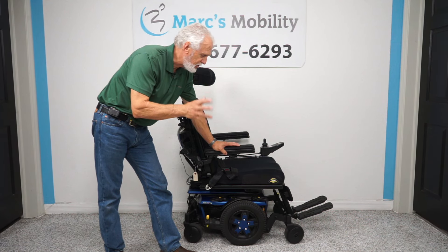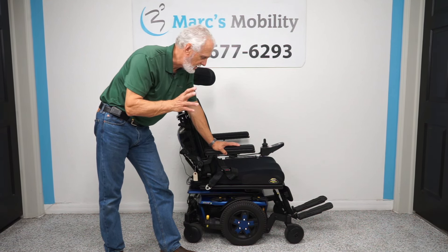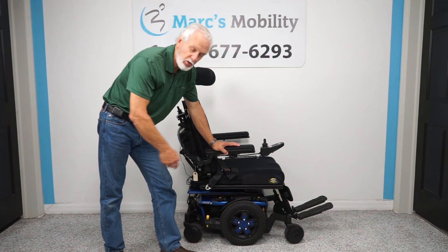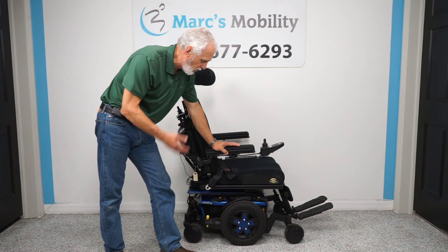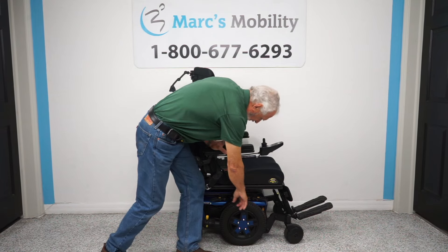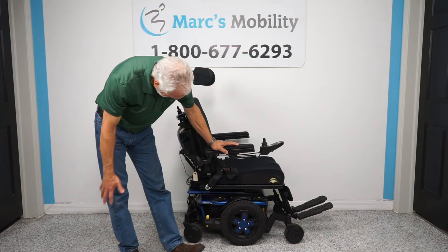If you're looking for a chair with a tilt but you don't want to spend a lot of money, this may be one you want to look at. It has 493 miles, it does have the electric tilt, it looks new, and it does have a little bit of wear in the tire — but other than that it looks fantastic.